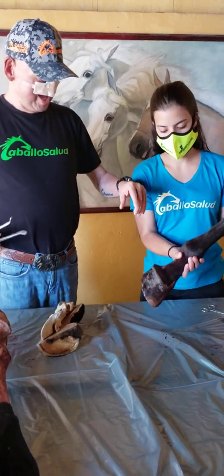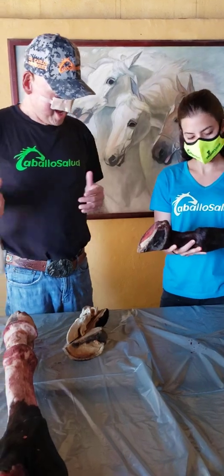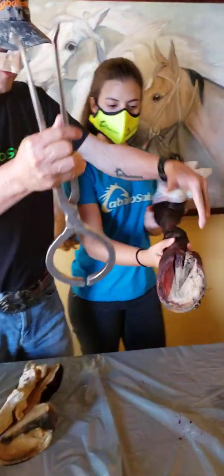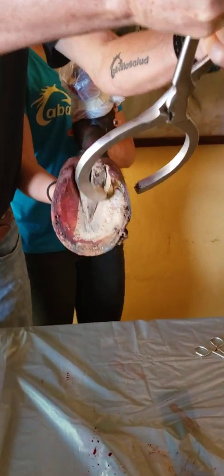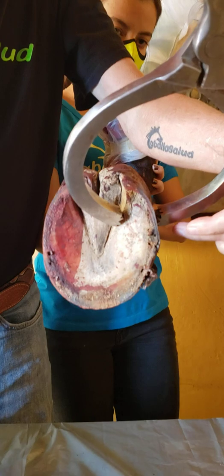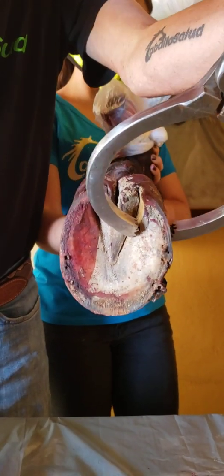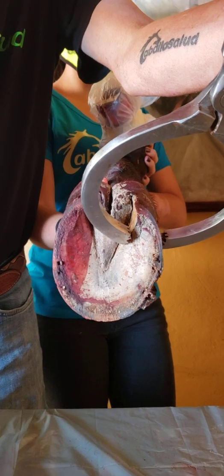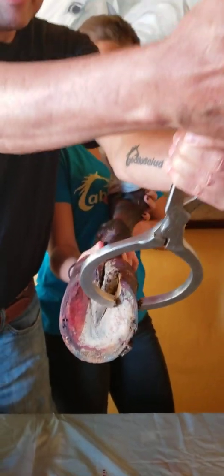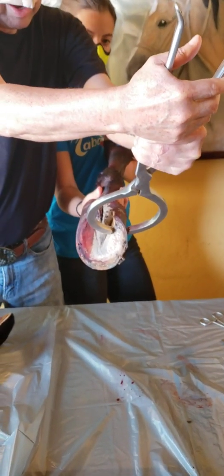With a helper or putting the hoof between my legs, I'm going to start by opening my hoof testers and I'm going to make pressure in the hoof wall and also in the bars. I'm going to make pressure — see everyone? Look at my hands.